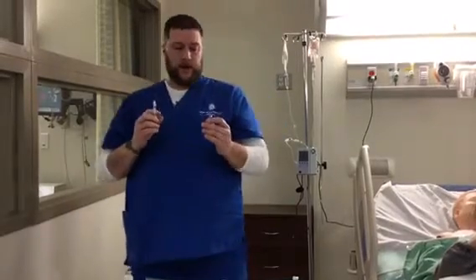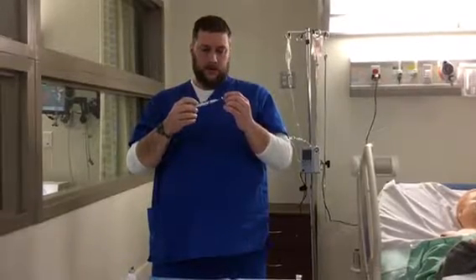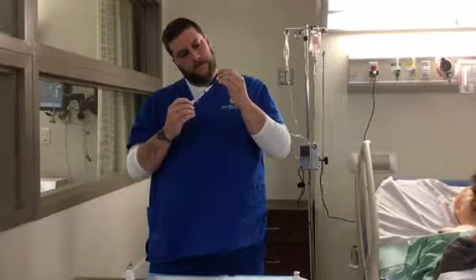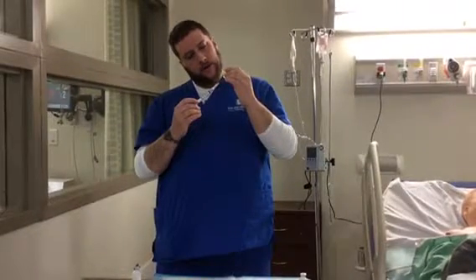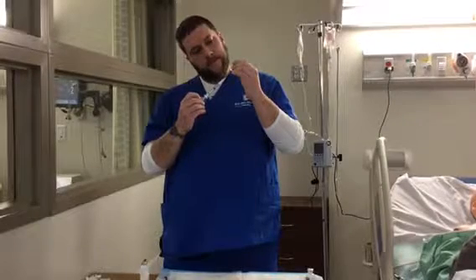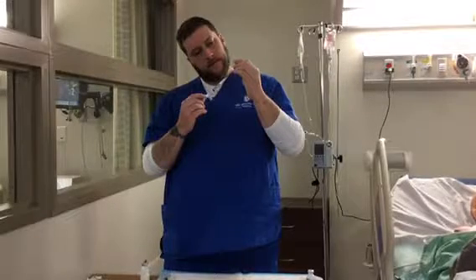Now, using a syringe with a filtered needle, at this point, you're going to insert the needle and slowly turn. You're going to withdraw all the medication, being careful to move the needle down as you go. And be careful to keep the needle in the vial the whole time, as to not break the seal and get all the medication.